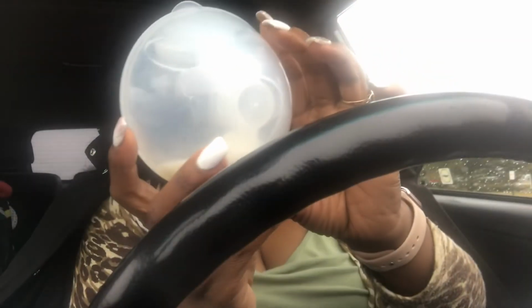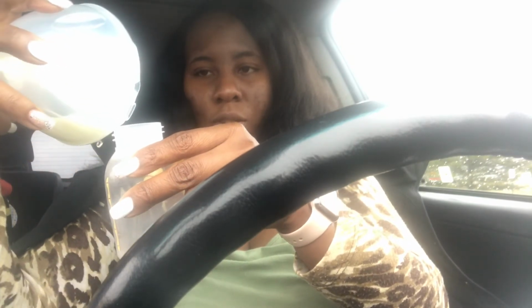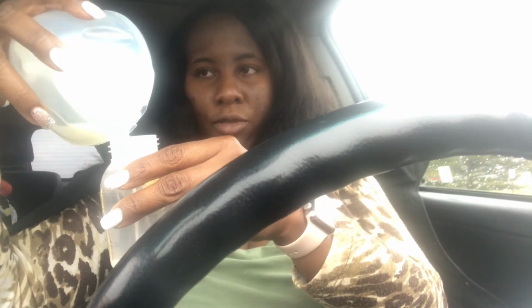So these are the cups. That's how it looks when it's full of milk. I'll go ahead and dump that out. Then I'll show a close-up of what the cups actually look like, probably when I get home later today, because like I said, I'm kind of in a rush to get back to work. There's a little pour spout. Just dump it in carefully.